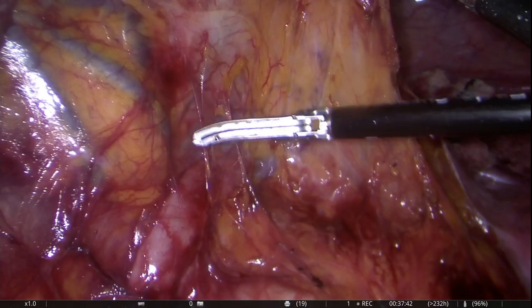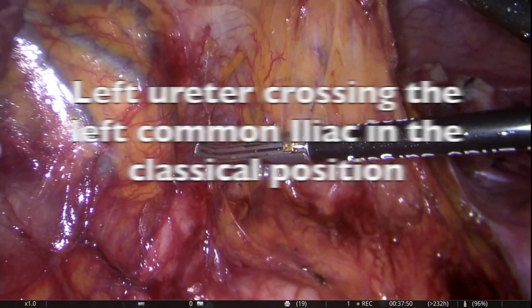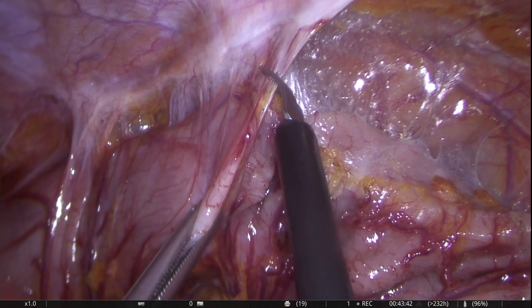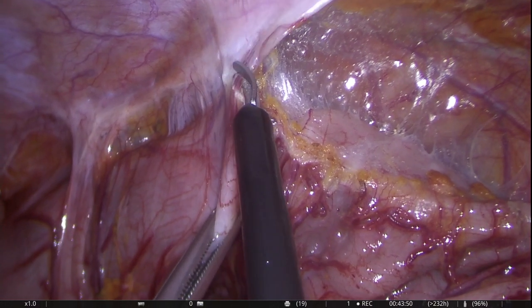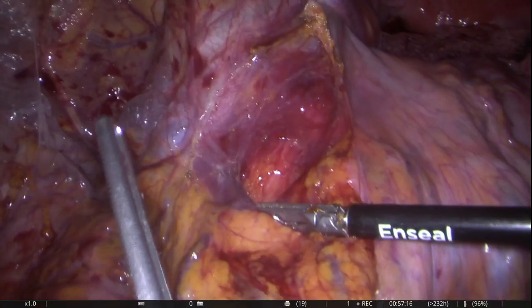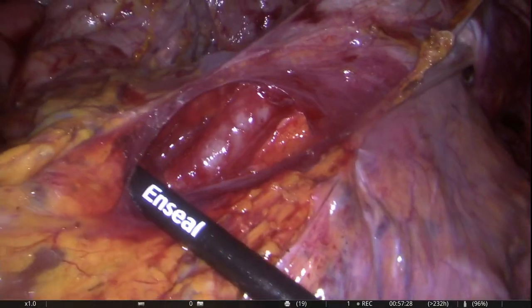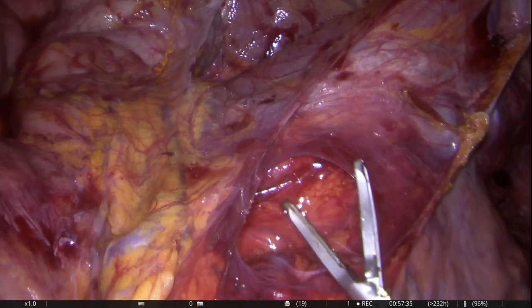Dissection proceeds medial to lateral, identifying and preserving the ureter. Once the lateral adhesions are taken down, the two planes — medial to lateral and lateral to medial — are joined together. Once again, it is very important to identify the ureter at this stage, which lies right underneath the dissection plane.